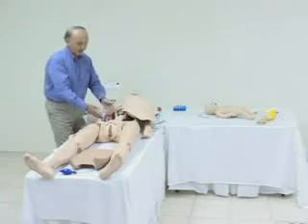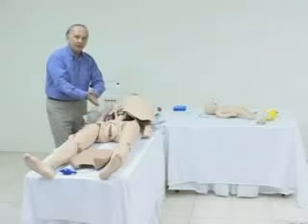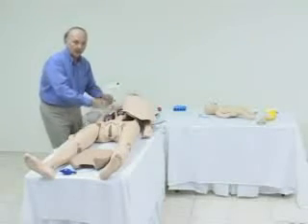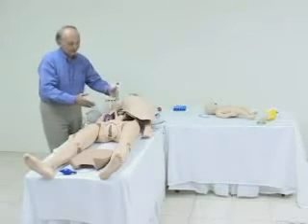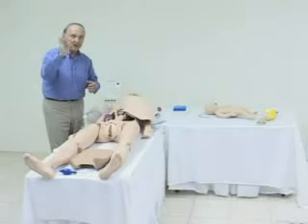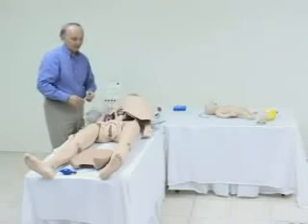The placenta can be placed either low in the abdomen or high. Similarly, you can place the placenta so that a fair amount of traction will be needed after delivery of the child and during the delivery of the placenta, or you can place the placenta so that it will easily come out. Another feature of this simulator is the fact that the cervix dilates automatically as the fetus moves down the birth canal. It starts out at about one and a half to two centimeters and dilates as the baby progresses down the birth canal. The cervix is easily removable.